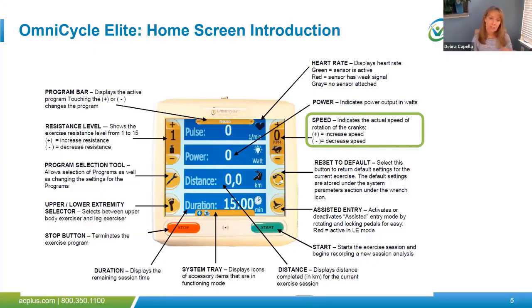So as I mentioned, sometimes the patient isn't able to really do a lot on their own, and we're just trying to get them moving a little bit. So the machine is going to have a default low range of motion that it can be going through. And then as the patient starts to actively participate, that RPM number will probably go much higher. And we'll talk about how we're going to use that as we customize our exercises with our patients moving forward.